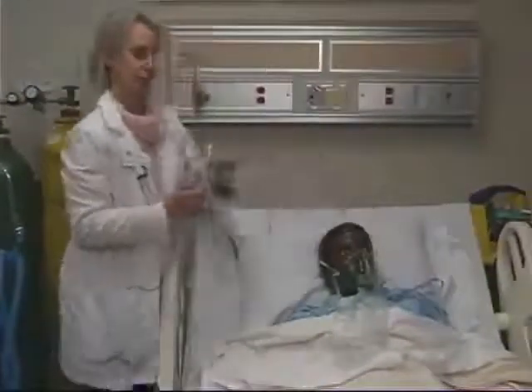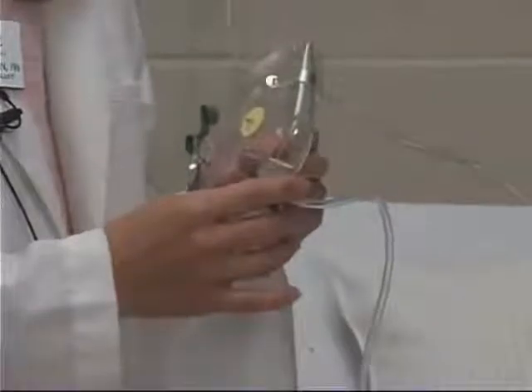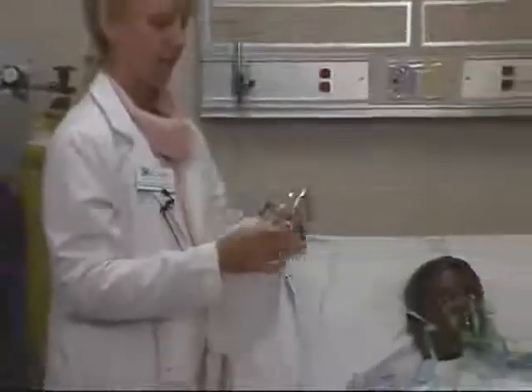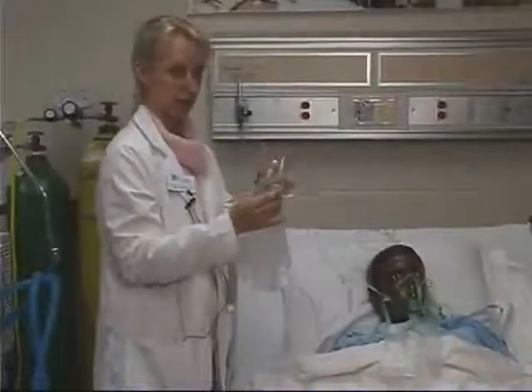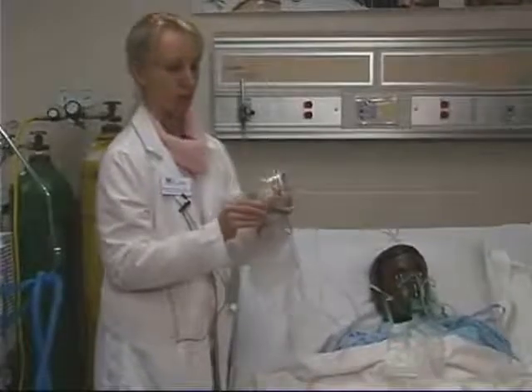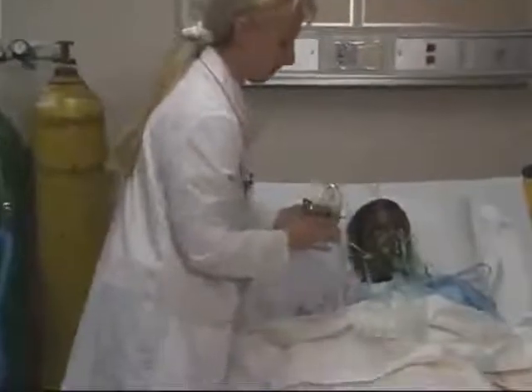And that ends my demonstration of a partial rebreathing mask. Now I'm going to show you a non-rebreathing mask. It's hooked up to the oxygen source the same way, and it's placed on the patient the same way, so I won't demonstrate those again. What I want to focus on is showing you the difference between the partial rebreathing mask and the non-rebreathing mask.